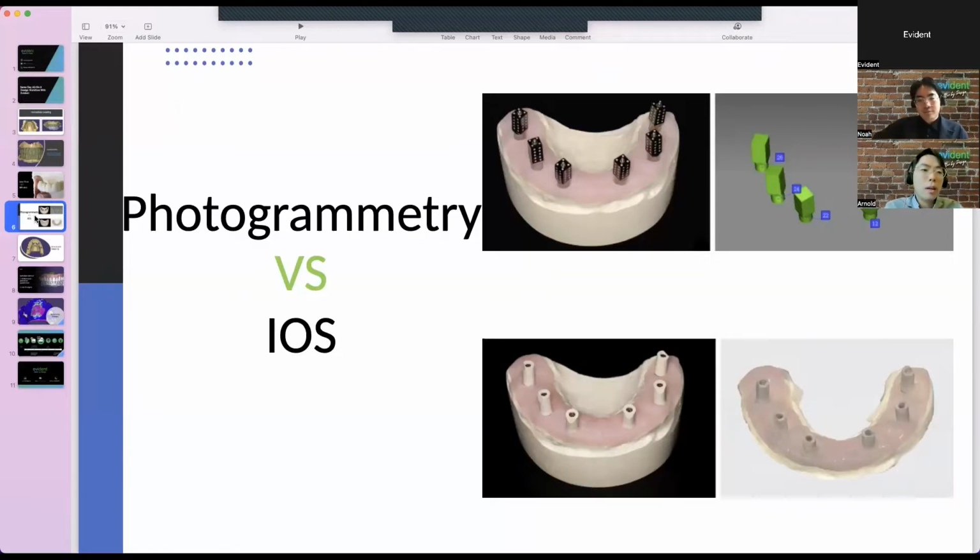Okay, so if you're concerned with scan accuracy, there are two ways you can prepare, right? Same as before, you can request the full bridge as planned, but because of that accuracy concern, you can also have the palatal jig bridge design with bigger access holes. If you could go to the next slide.